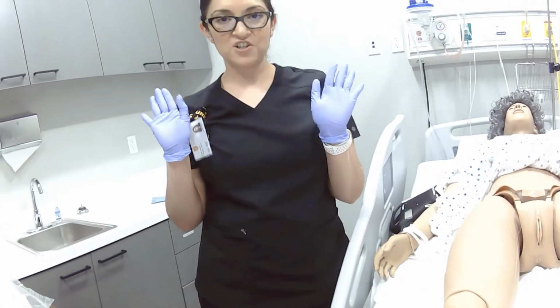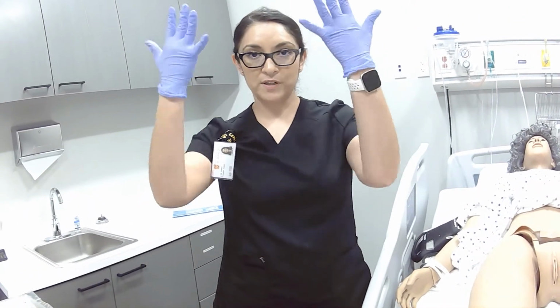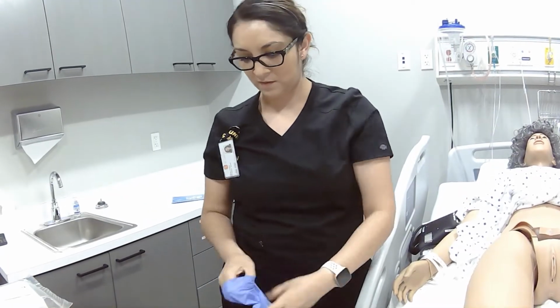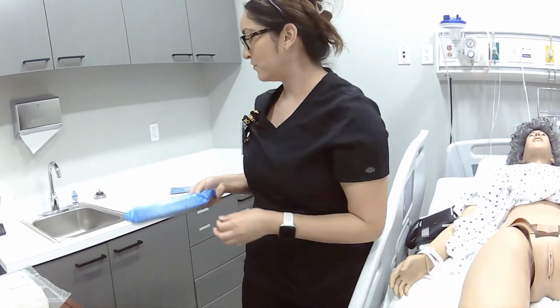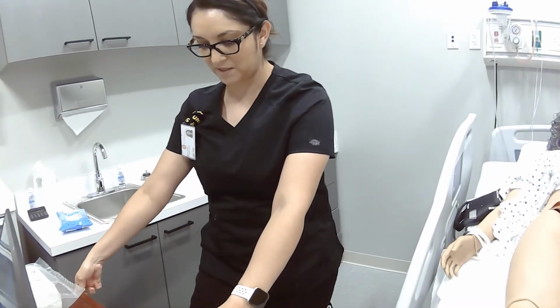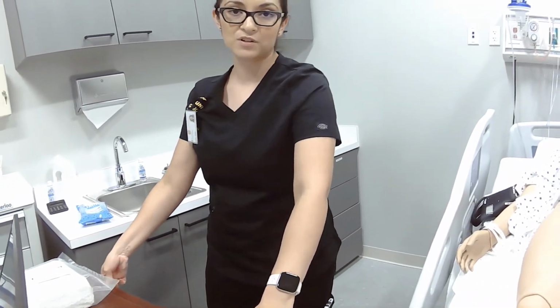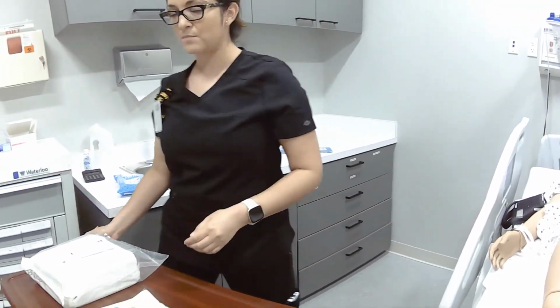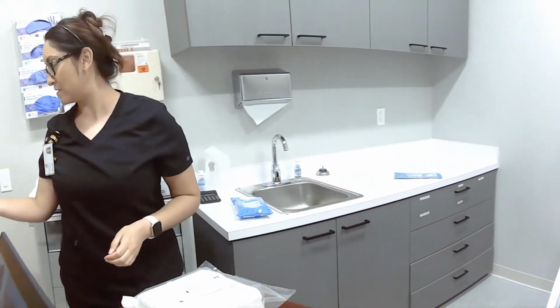So now that I've finished with peri-care, I'm going to remove my soiled clean gloves. Move this out of the way, or throw that away, because that should be empty, depending on how many towels or how many wipes come in your kit. And then I'm going to do hand hygiene and put on a new pair of clean gloves.